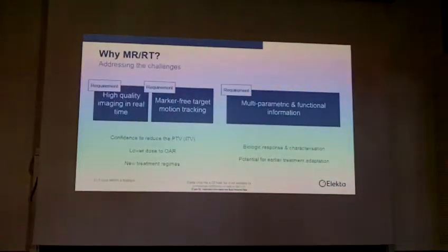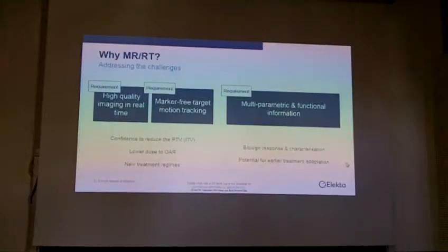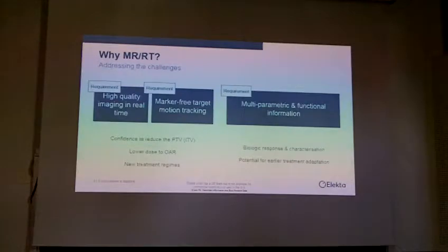Regarding multiparametric and functional information, to get more information from functional imaging and to get the biological response, how the tumor responds to your treatment, and the characterization is also very important.